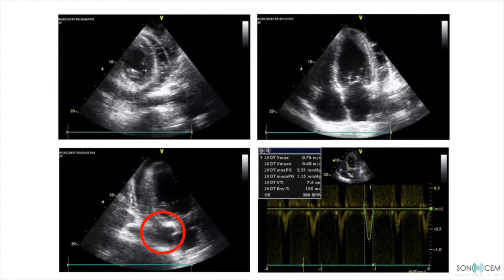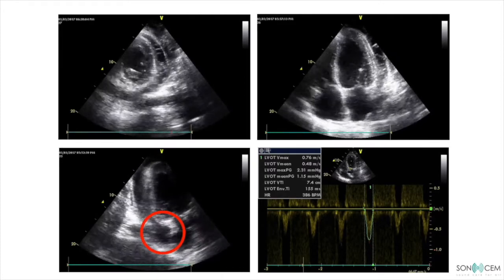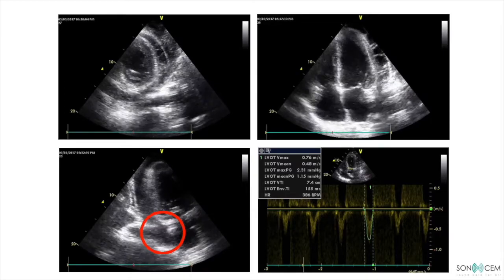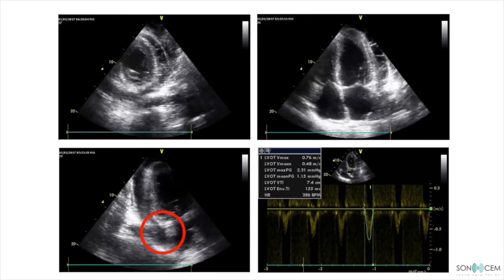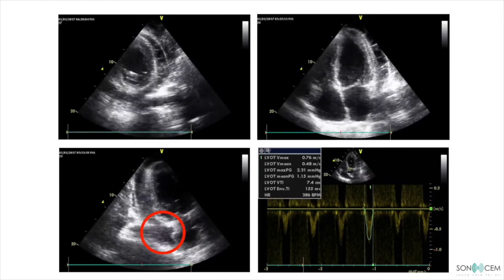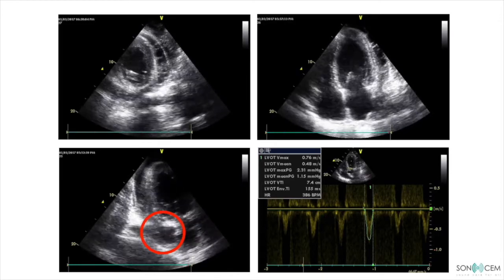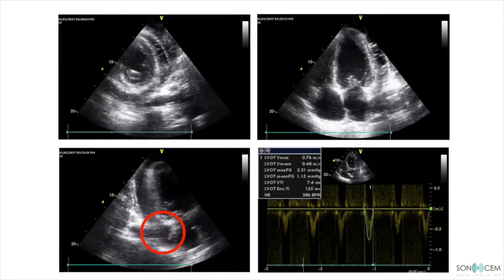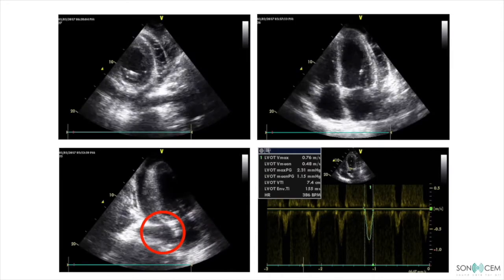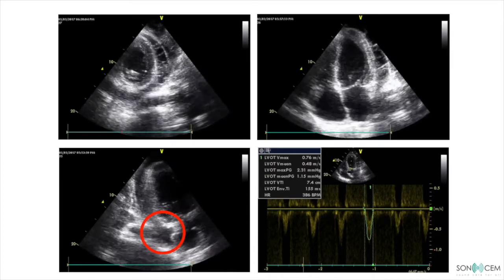Next, we performed focused cardiac ultrasound. As expected, there was pericardial effusion accumulating surrounding the heart with fibrinous-like structure. It was actually difficult to view the entire heart with the sternal dressing and the chest drain at the subcostal area. We tried to visualize the heart at every angle that we could. Then we found some loculated effusion compressing the LA chamber in the apical 2-chamber view.